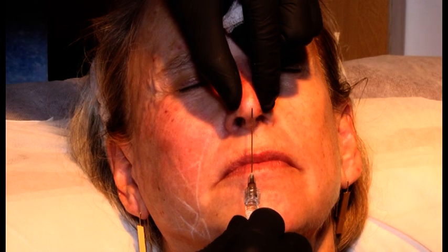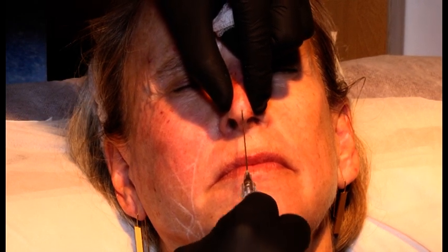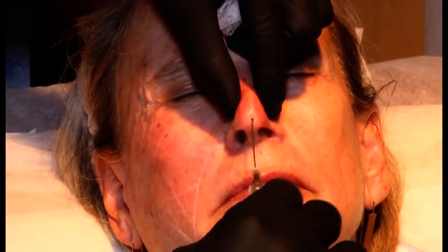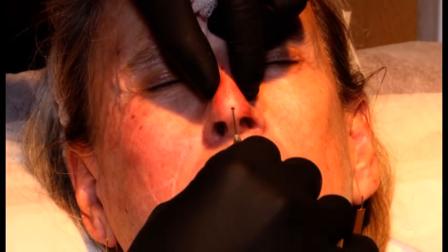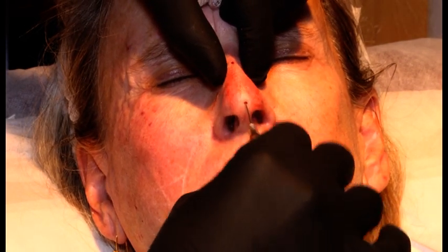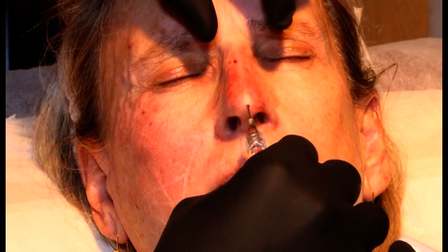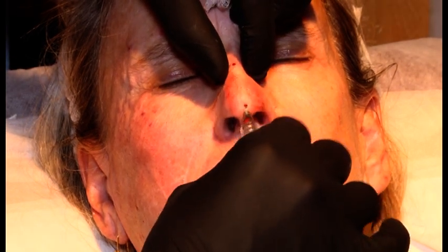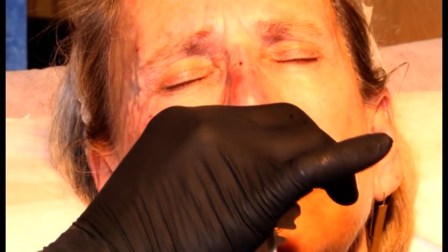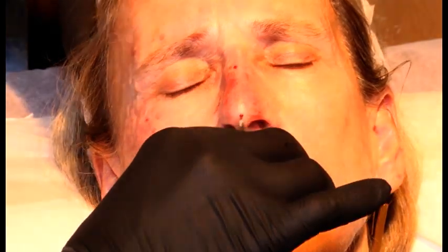And now, as the last one, I will go into the subcutaneous plane. This is actually the area of the leveled anatomical layer of the dorsal nasal artery. So that means that I cannot have any resistance. I like to call it the tea time technique. I have one pinky up, and as you can see, I don't use any force.